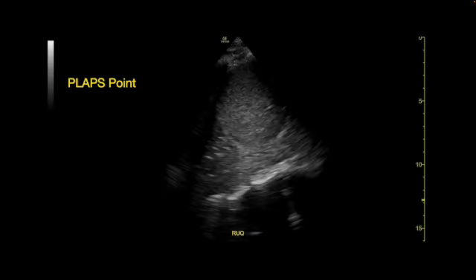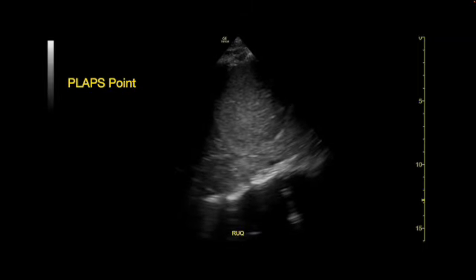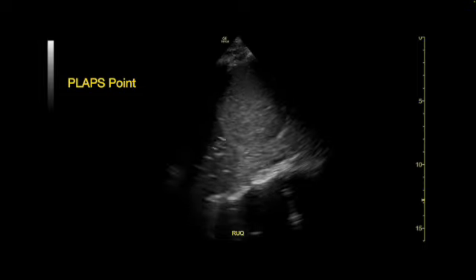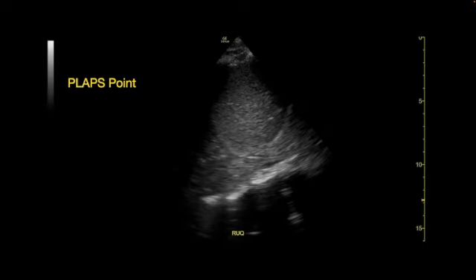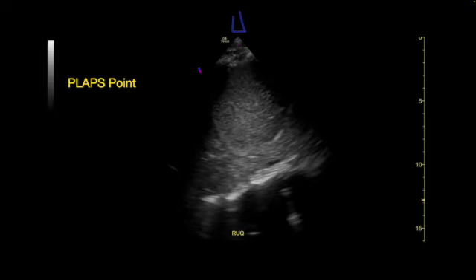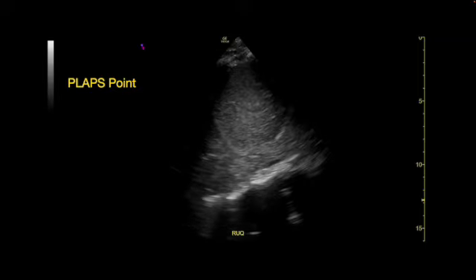All right, so again, pneumonia can take on various shapes and sizes. Here is another finding in pneumonia, a more severe pneumonia, let it be known, on point-of-care ultrasound. Now, this is at the PLAPS point, which is basically the upper quadrants or the mid axillary line in the coronal plane. So here's our probe, right? This is the head, right? And I know that because here's our probe indicator that faces the patient's head. And here's our feet.